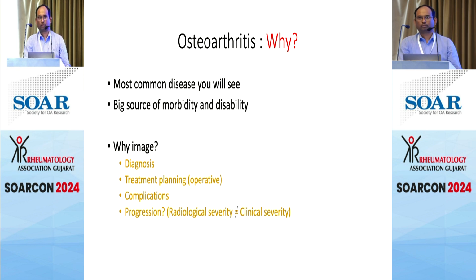Complications are one of the most important indications. I am not in favor of saying that imaging helps in seeing the progression of the disease process, because the radiological severity is definitely not similar to the clinical severity.